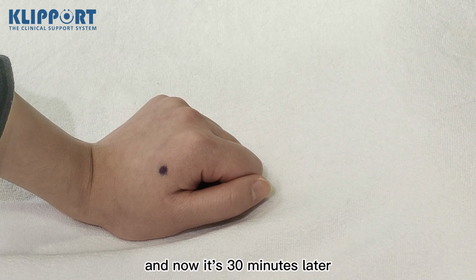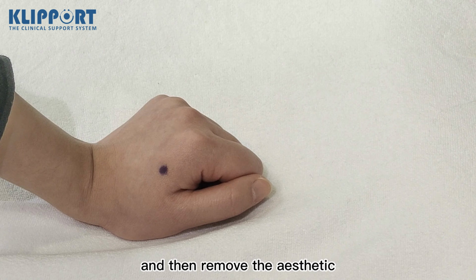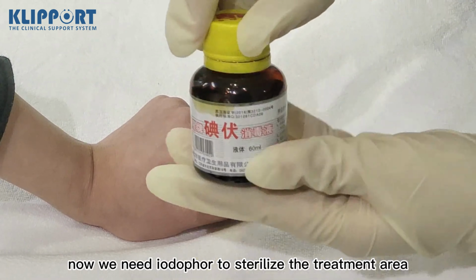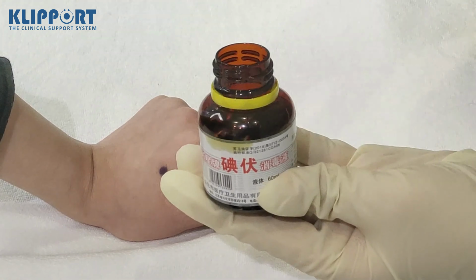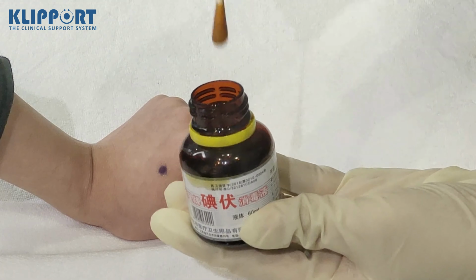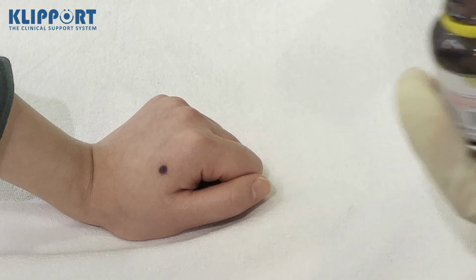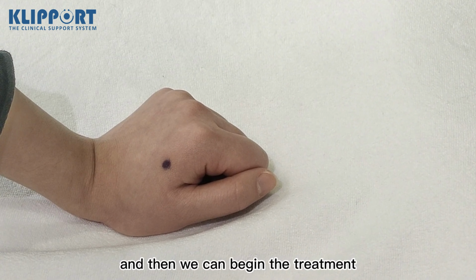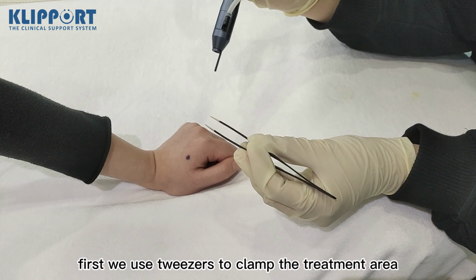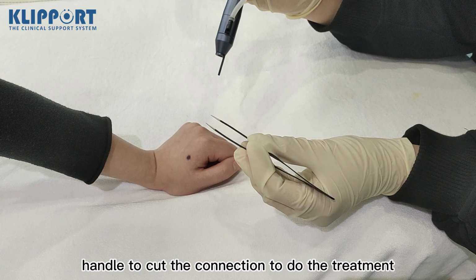And now it's 30 minutes later. First, we peel off the plastic film and then remove the anesthetic. Now we need iodophor to sterilize the treatment area. And then we can begin the treatment. First, we use a tweezer to clamp the treatment area, then use the handle to cut the connection to do the treatment.